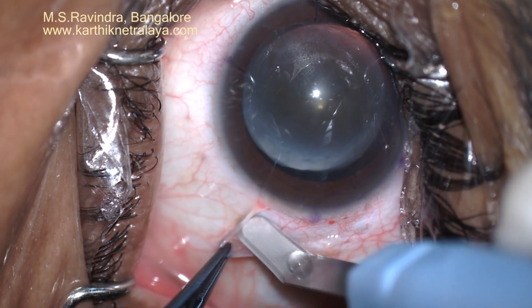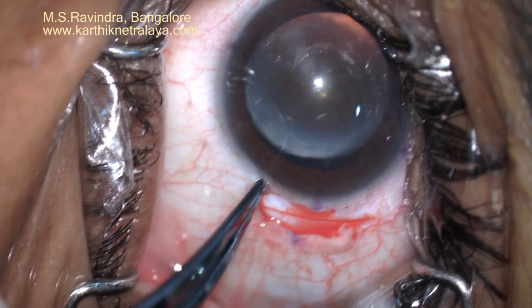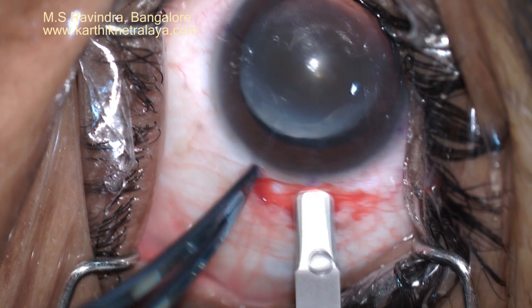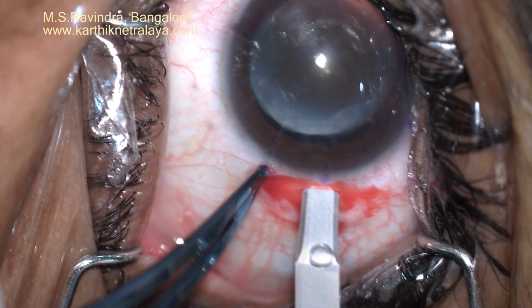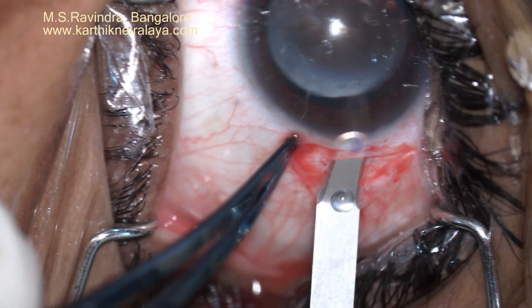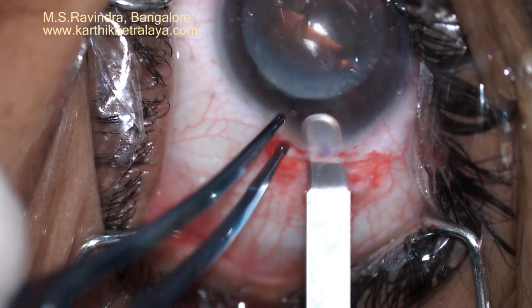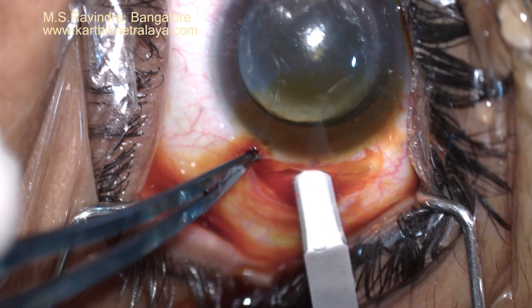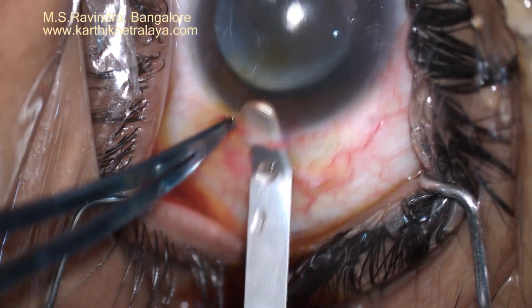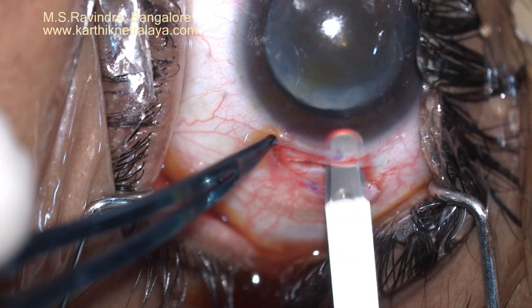A 6 mm tunnel was created on the temporal side — a sclerocorneal tunnel about 2.5 mm long. You can see the horizontal mark at the limbus. A drop of viscoelastic is put just before making the tunnel.